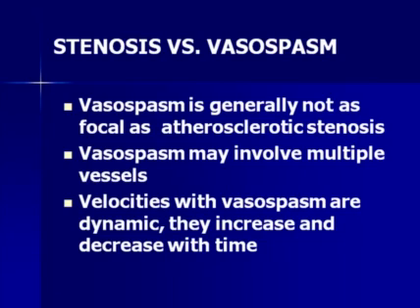How do we tell stenosis from vasospasm? Again, vasospasm is not going to be focal. If we have a stenosis, it's really going to be focal, and vasospasm actually can be triggered in multiple vessels within the brain. And as I said, these are dynamic and will change over time.